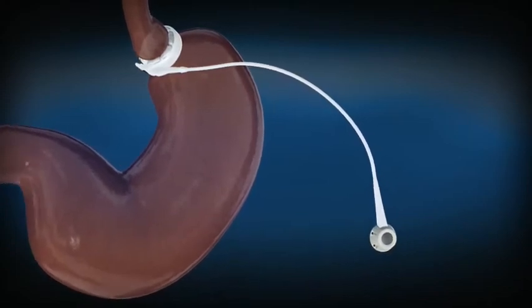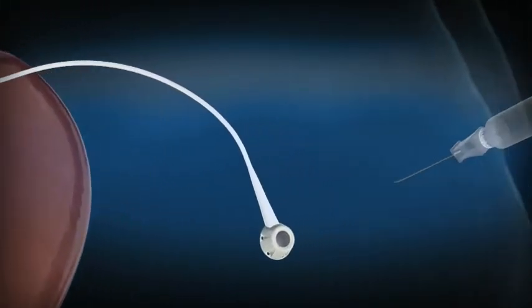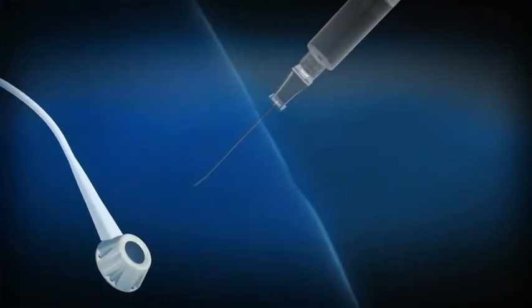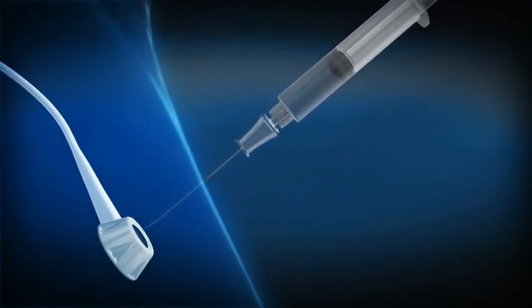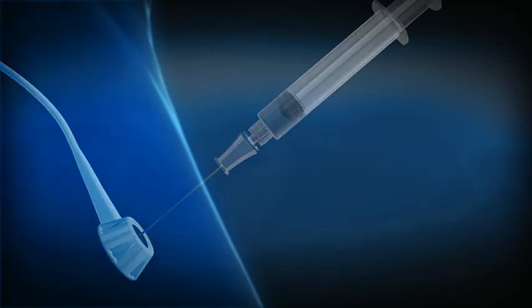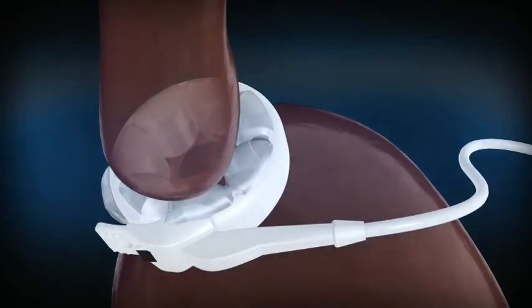Using a fine needle, saline solution can be added or removed from the band to find the right level of restriction. As saline inflates the inner surface of the LapBand system, the stomach outlet becomes smaller.